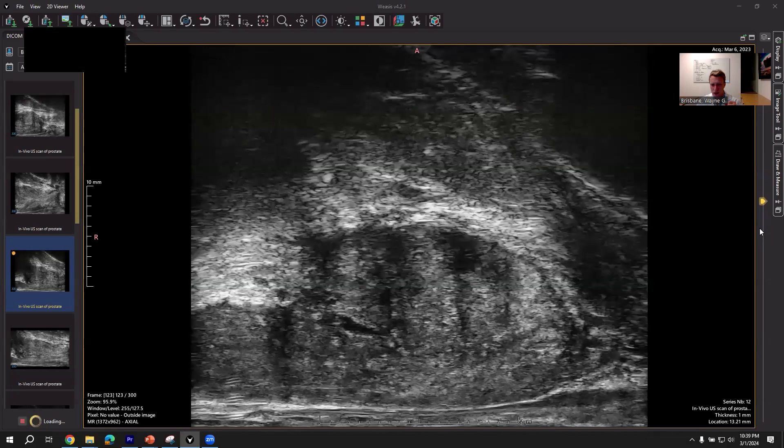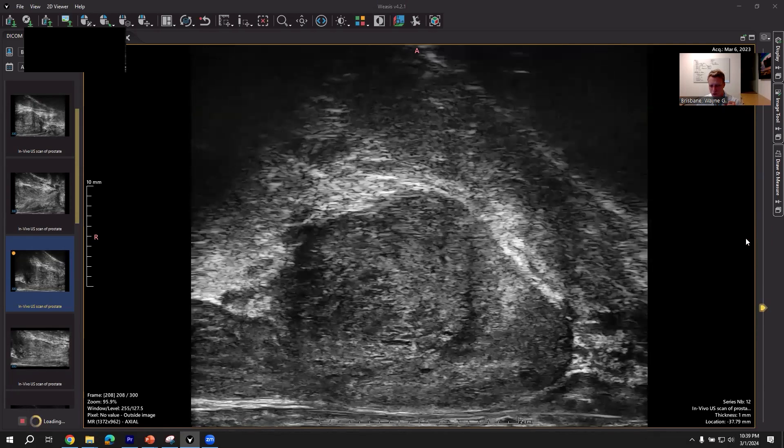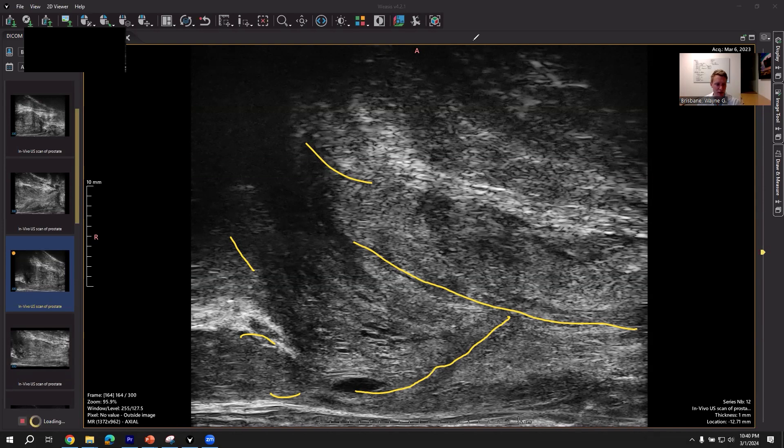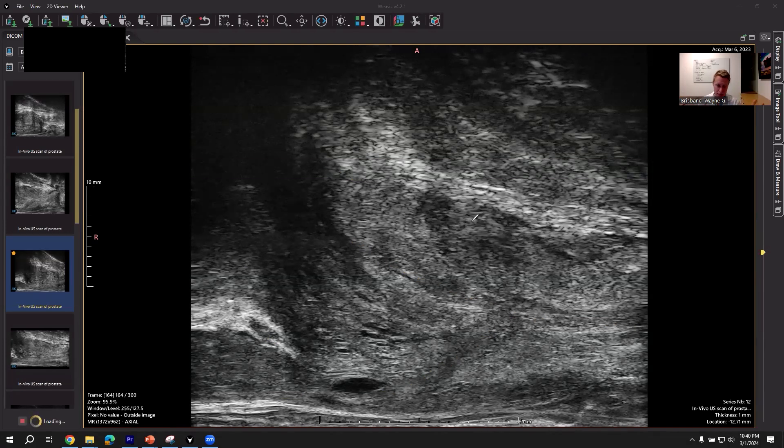Here is kind of this scan going through — I'm going to show you. This is the midline, just to give you a few bits of data. Here is your bladder neck, seminal vesicles, ejaculatory ducts, and urethra. Obviously there's super high resolution here, but this will work great regardless of whatever ultrasound you have. When you are first doing these biopsies, you're going to figure out where you're going to do the biopsy — you can do that with fusion, or with micro ultrasound identification of the lesions, however you're going to do it. Spend the first part just planning where you're going to go: are you going to do systematics, how many, and where the systematics will be relative to your target.